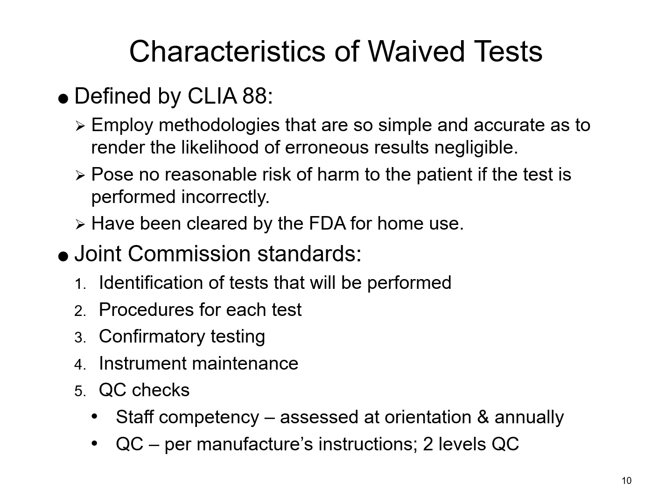Now, I also want to note that part of that QC/QA policy, you do have to have for waived testing as well, and it's going to include a way to assess staff competency. Typically, it's assessed at orientation and annually.